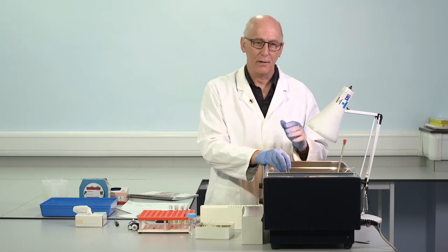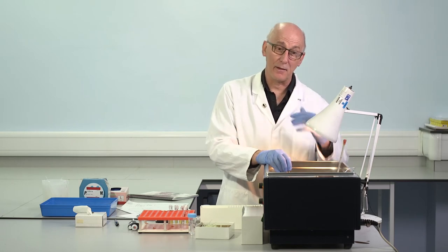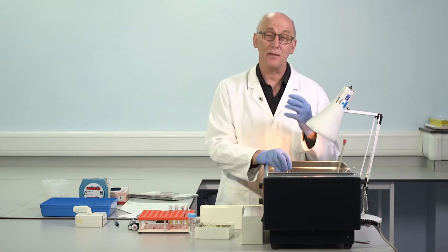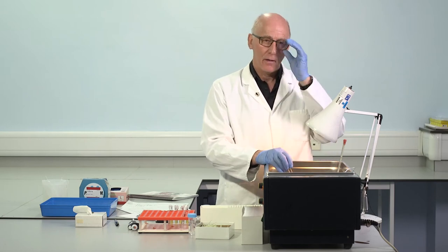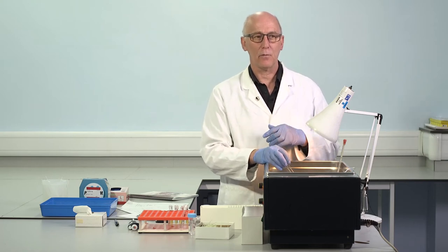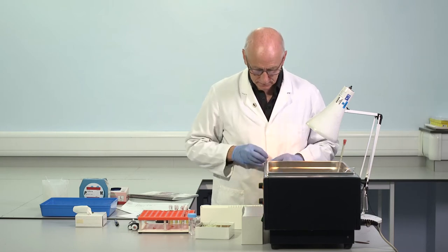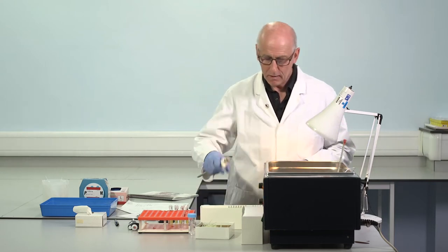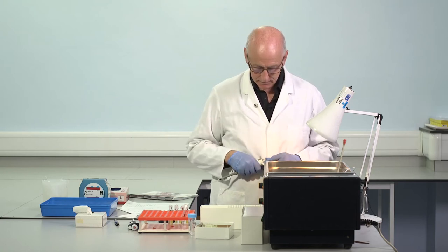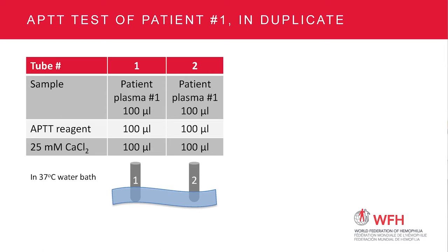And as you see the next tilting, you'll see that the fluid is moving down the side of the tube and then back to the bottom. And we need the reagent in its bulk position in the bottom in order to observe when the clot forms. The majority of clots which form will be a fast process, will be a solid clot, when it's a normal result, when it's a mild abnormality. It's fairly obvious with practice that the clot's formed. The longer the clotting time, the weaker the clot that occurs. So we're approaching 3 minutes, so we'll add the calcium to this first patient sample whilst we're talking.